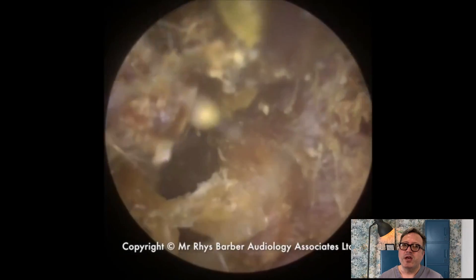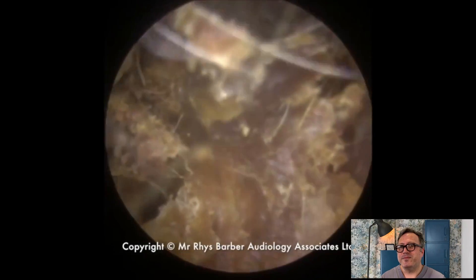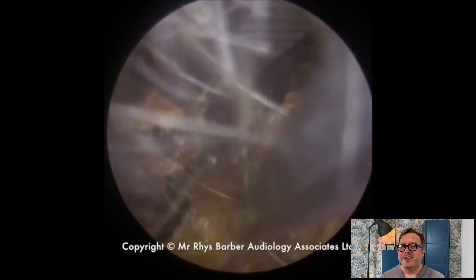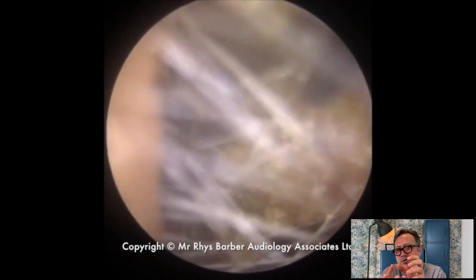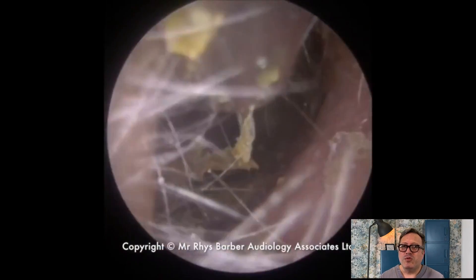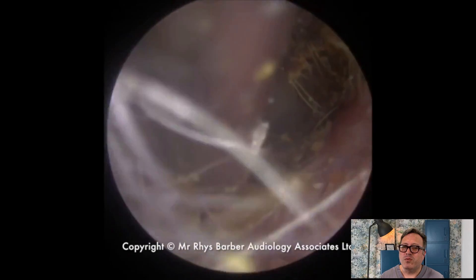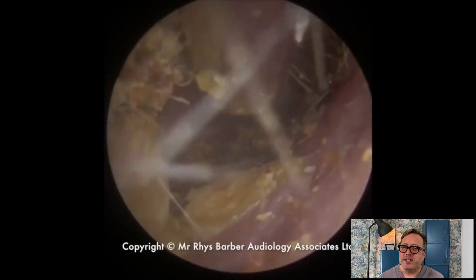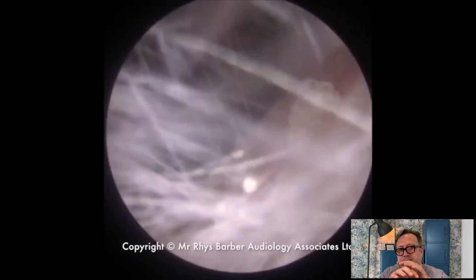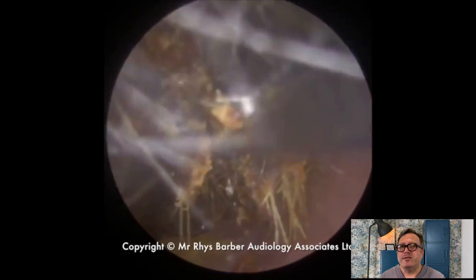Very, very slowly trying to work this around, trying to keep it in one piece. If I detach this section the bottom is loose, but the section to the left hand side is still quite firmly attached — I don't think this is going to come out with the Zolna tube. So the crocodile forceps — we're just going to grab that now. If we're lucky the whole thing will have enough structure to pull everything out in one go; if it's too dry it'll shear. You can see the texture: the wax has a grainy, bobbly texture, and the dry skin is a little bit smoother.